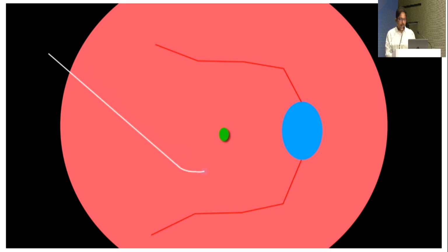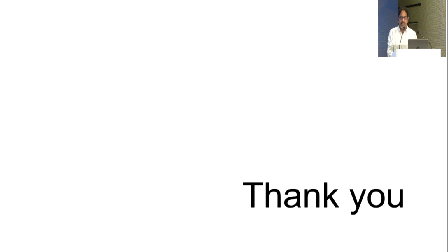The last technique is you need not remove it. You create an inferior bleb of RD by injecting submacular BSS, and then push the PFCL bubble into the lower part of the macula and ask the patient to maintain sitting position post-operatively so that the bubble migrates out of the fovea into the inferior macula. So this also is one technique which has been tried. Thank you. I'll stop here.